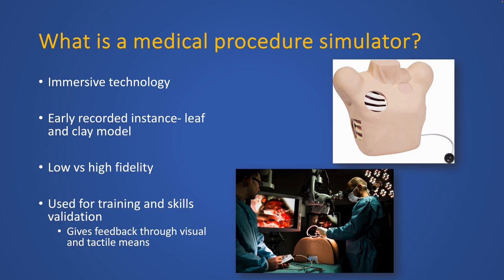Simulators are either low or high fidelity. Models are typically considered low fidelity if they train on one specific task, whereas high fidelity models can mimic entire procedures or patient encounters. Virtual procedure devices can also provide tactile feedback using force and torque movements to simulate touch and movement.